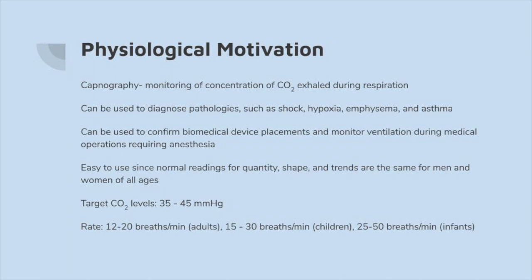Capnograms are helpful and easy to use since normal readings for quantity, shape, and trends of the waveform are the same for men and women of all ages. Furthermore, deviations in the capnography waveform can be used to diagnose a large variety of respiratory arrhythmias and other medical conditions, such as shock, hypoxia due to asthma, hypoxia due to medical obstruction, emphysema, and heart failure. Capnography has also become integral to monitoring the effects of anesthesia during procedures.